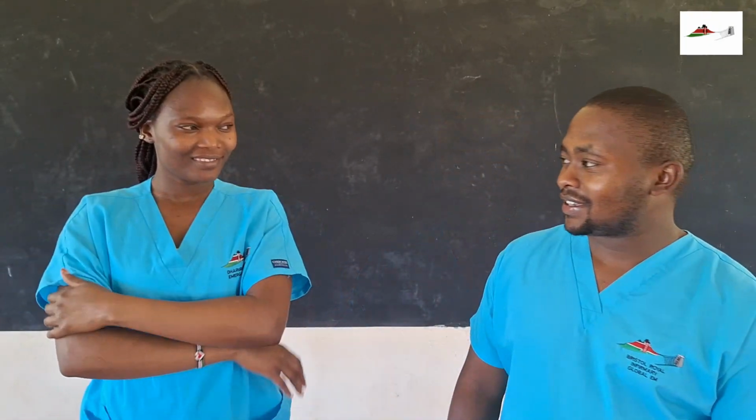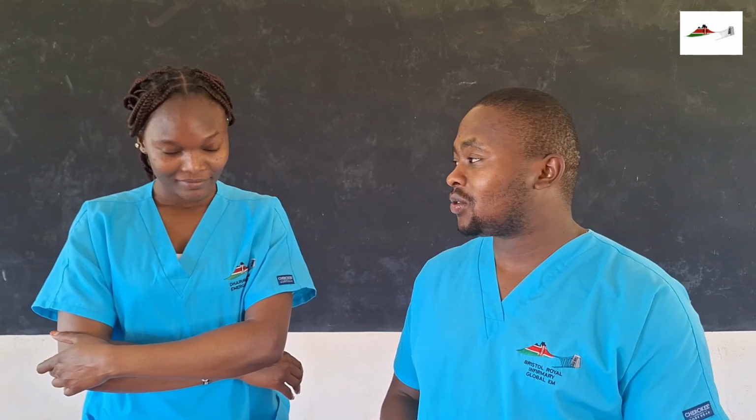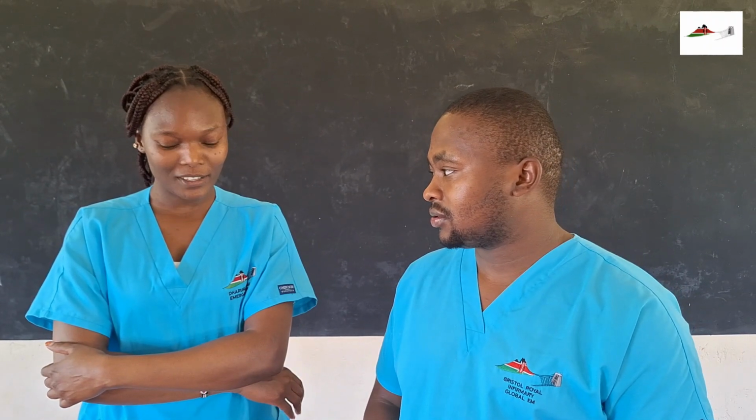Today, we want to demonstrate to you how to do high quality chest compressions. In this case, we are demonstrating in a safe environment whereby we are using mannequins, and this is a safe environment because here we are able to sharpen our skills as well as knowledge, causing no harm to the mannequin. Whatever we demonstrate here is what we are expected to do in a real life situation. Let's demonstrate how to give high quality chest compression.